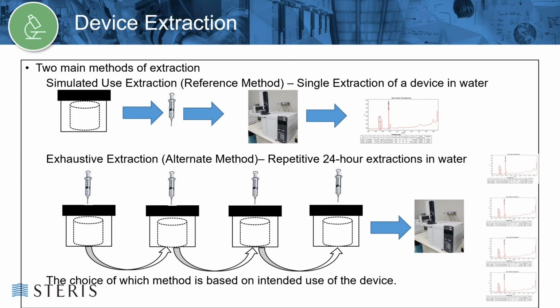Ethylene chlorohydrin residues are obtained through reaction of ethylene oxide with chlorinated compounds, such as bleached paper. Ethylene glycol is formed by the reaction of ethylene oxide and water. Limits for ethylene glycol were removed from the ISO 10993-7 Annex. Annex 1 discusses its removal in detail. We typically test patient contact portions of a device for ethylene oxide and ethylene chlorohydrin residues.